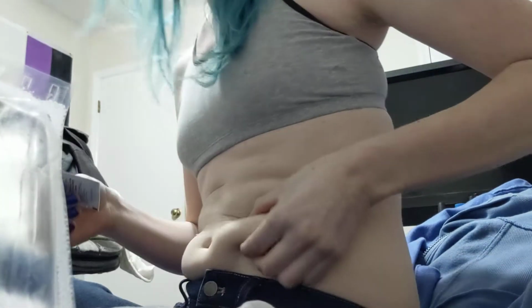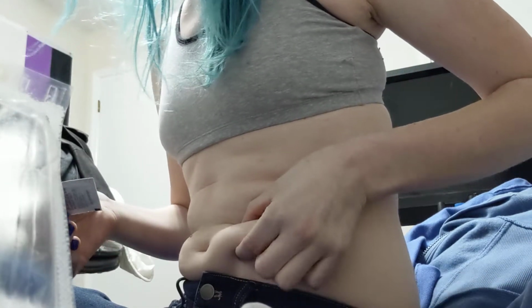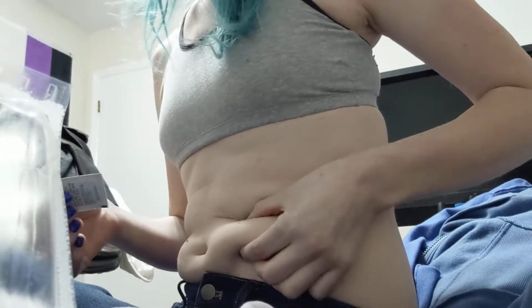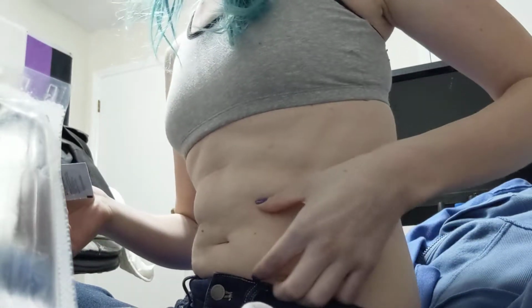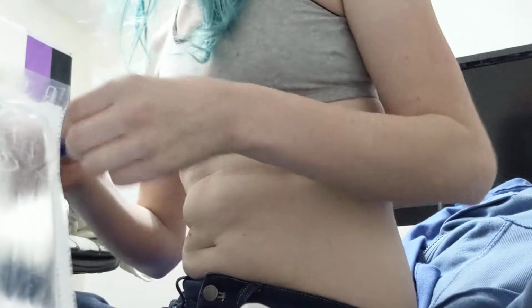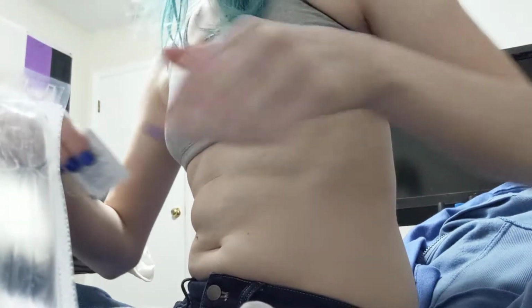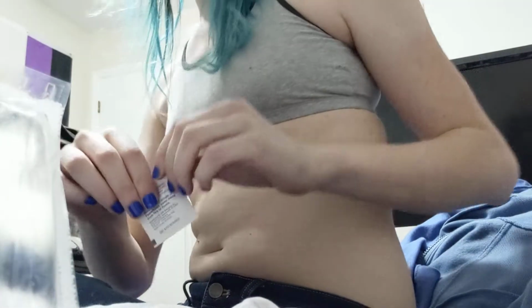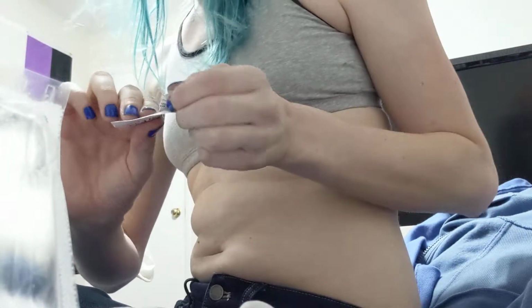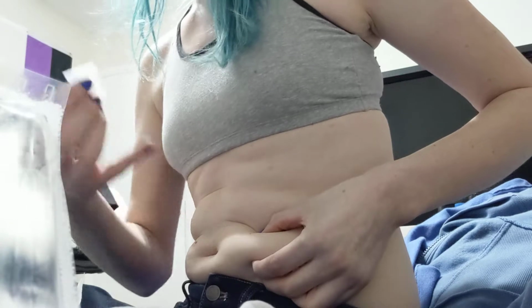You want to find a little bit of fat either on your belly or your butt or something like that, somewhere where if you tense your muscles, there's still a little bit of fat there. You want at least the length of the needle, a little bit longer than that, so the needle doesn't go into muscle. I do subcutaneous injections, so that is what I'm doing. If you're doing intramuscular, you want to inject it into the muscle.